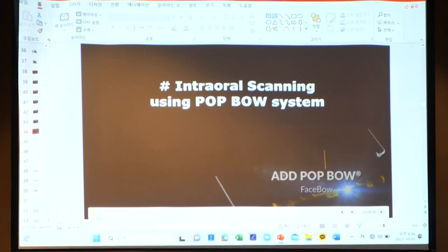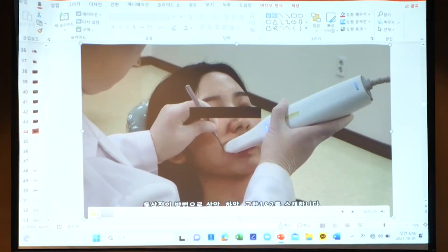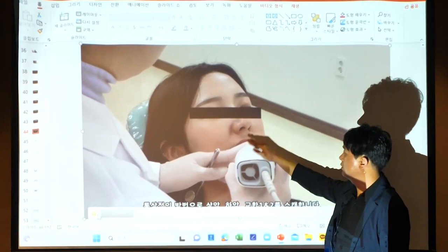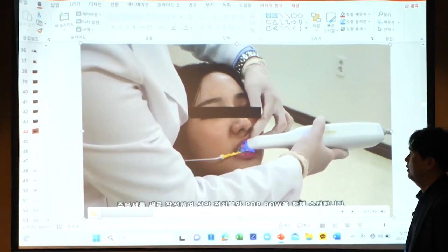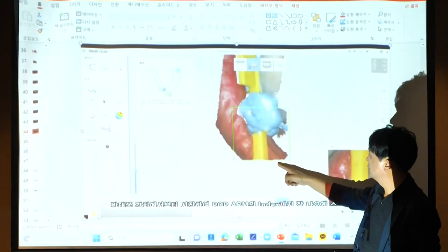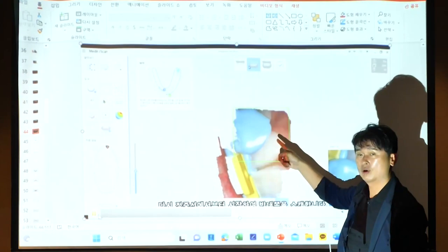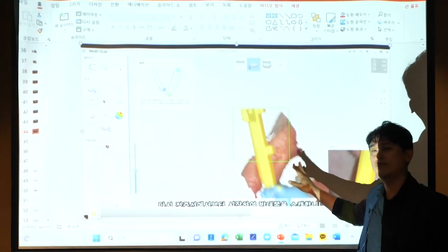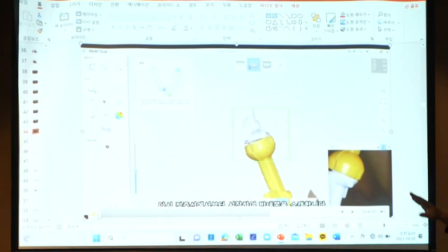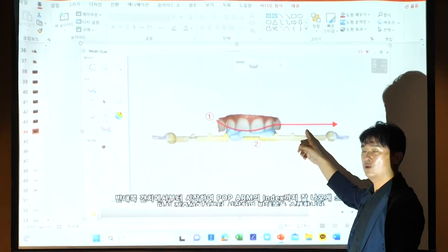If you have an intraoral scanner, it is not necessary to send your model to the dental lab. So after taking impression of upper jaw and lower jaw, you take impression of this bite. So first of all, an upper intraoral scan, lower intraoral scan, and then you take the bite like this. And then from the anterior teeth, you can scan this purple reference point. You can see the reference point. It's not necessary to scan perfectly. You can only scan this part, and this wing part. That's all. And then you have to send this STL file to the dental lab. And then in the dental lab, they open this file and merge the design files of this one. Anyway, this reference point is important too when you take impression with an intraoral scanner.